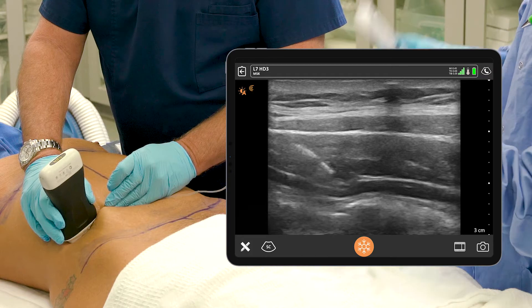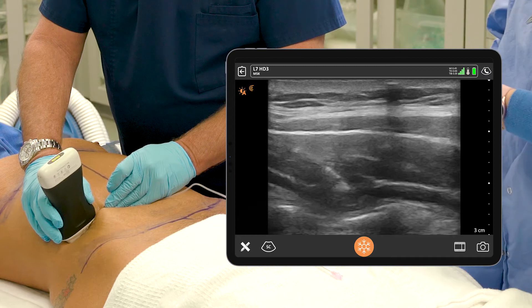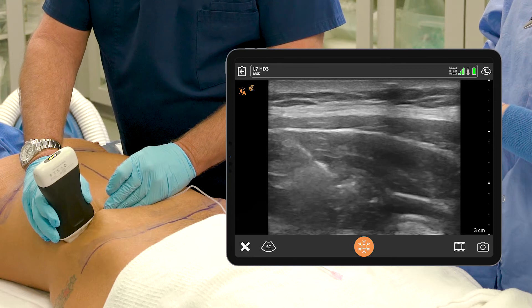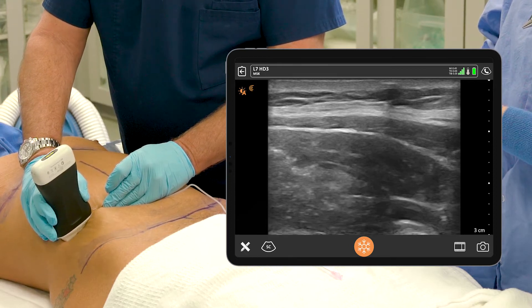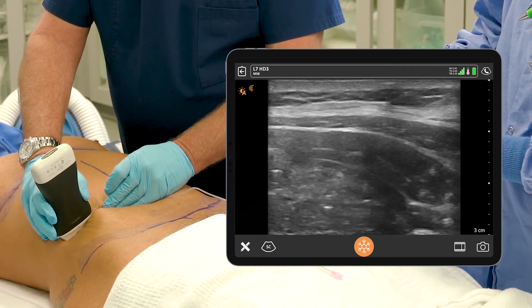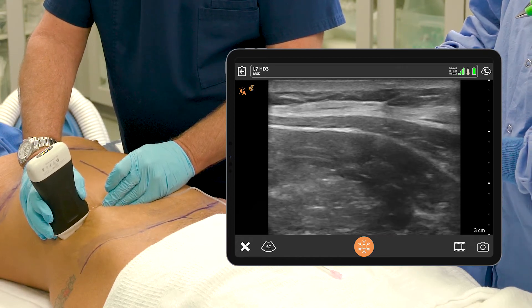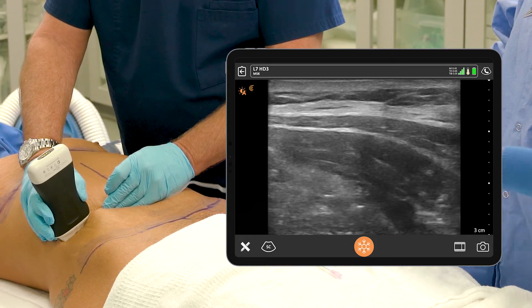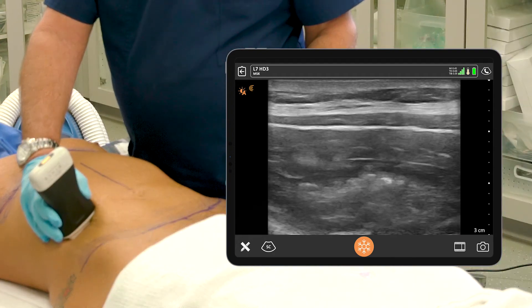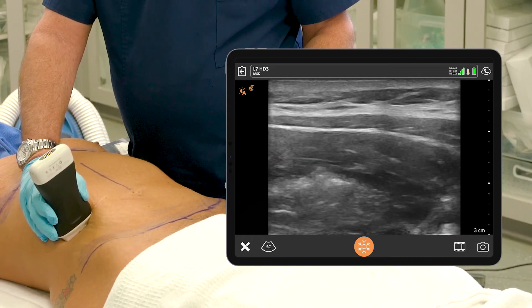Usually it's not that fast — 10 seconds is pretty fast — but typically it takes about 35 to 40 seconds. And there you can see it splitting and separating the muscles. The patients get such good pain relief from this. Because it's a 60 cc mixture, I'll reserve 10 cc's — five from each side — to directly infiltrate the area where we close the diastasis above the umbilicus. With that they get really good pain relief and are in the PACU for about an hour, compared to three or four hours with a mommy makeover before this technique. You can see the internal oblique being pushed upward and the transversalis being pushed downward.